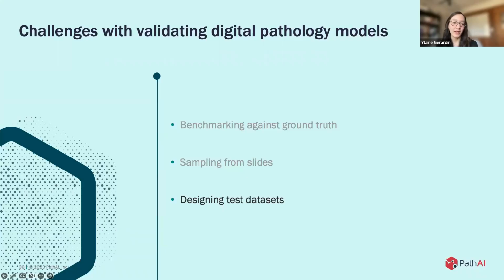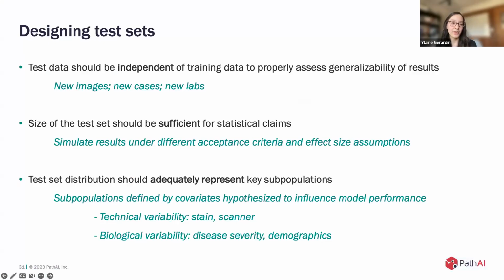So finally, moving on to the third challenge, which is designing of test sets. When we want to design test sets, we want to make sure that the model performance is going to be reflective of its performance in the real world. And there's three main things to consider here.